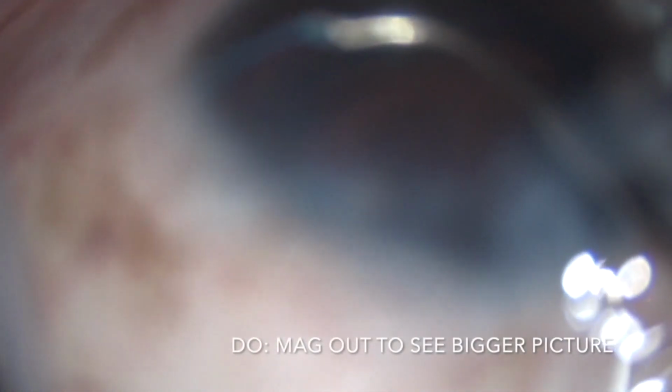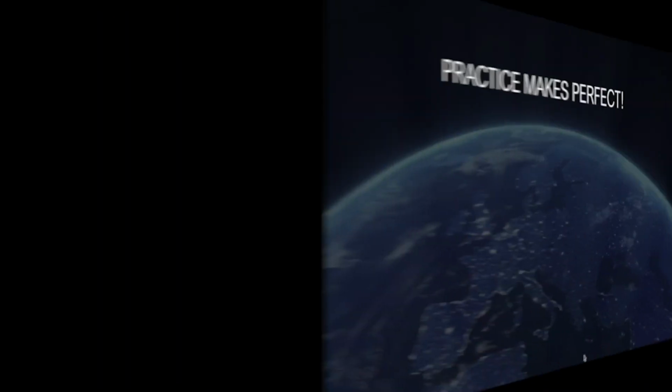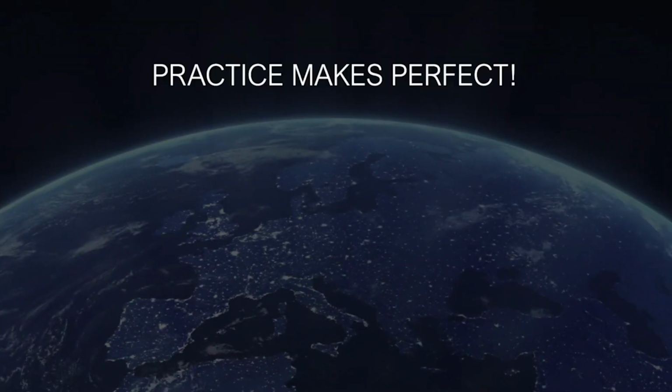That way you have a nice amount of tension on the microcatheter, which will allow you to perform the goniotomy portion of the procedure. I also tend to mag out when I perform the goniotomy portion so I can make sure I see a more global picture.